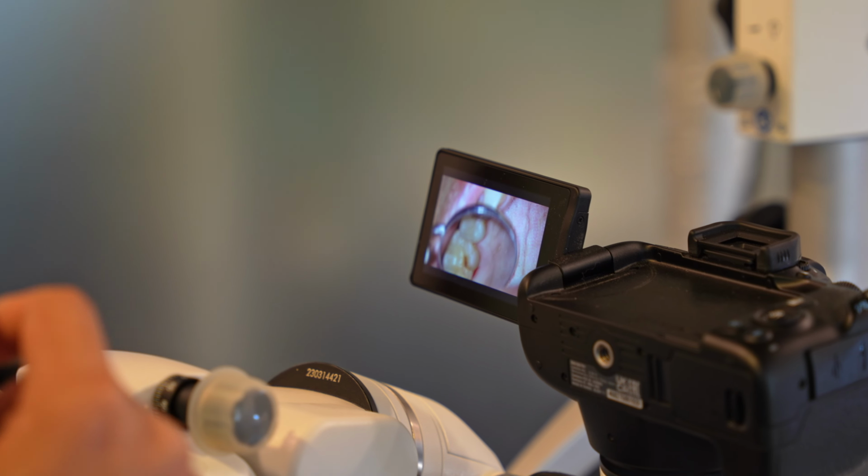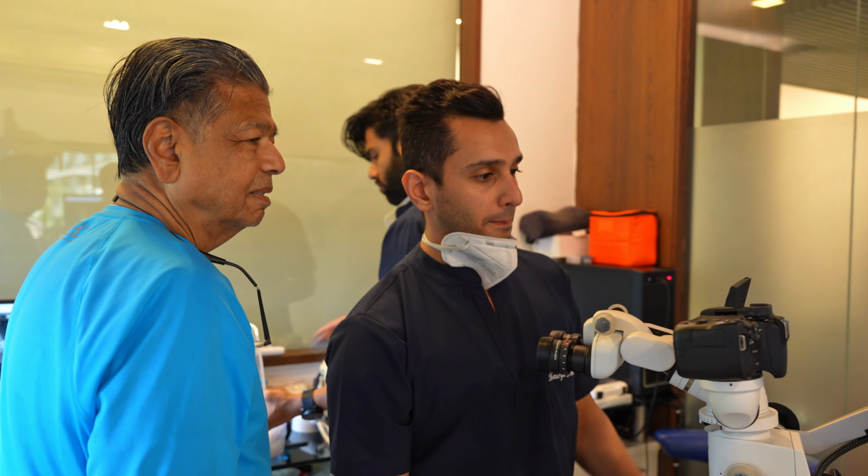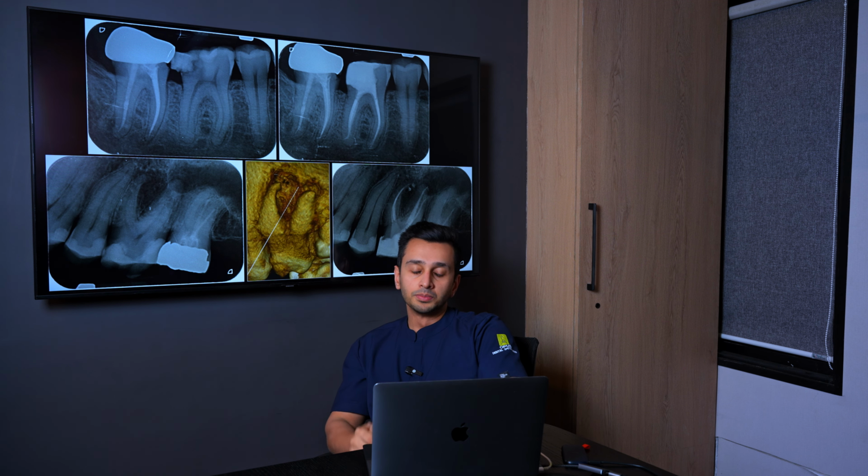We record things while we are talking to the patient and looking through the microscope, and then we can put it up on the screen to show them the actual problem, what's actually going on, any mishaps or complexities as well. That way it's very transparent between the patient and the clinician. Expectations are set from the very get-go, and I think patients understand much better when they see things rather than just being fed information verbally.